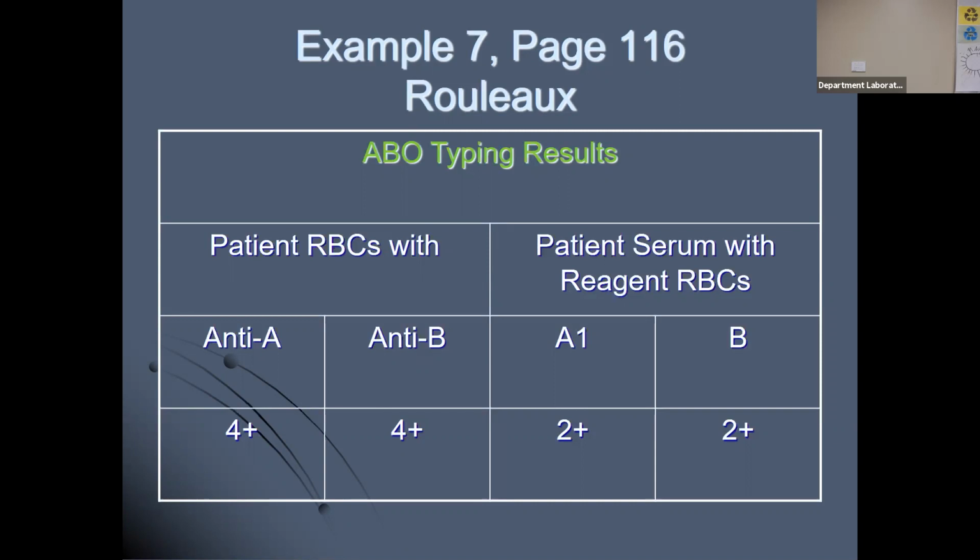And remember a couple lectures ago, I told you to never look at your ABO interpretations under the microscope. In typical situations, you wouldn't. In this case, if you were to look at these 2 tubes under the microscope, what would you see? You would see the stack of coins. You would see Rouleau. That's another way you could say this is not true agglutination, that is Rouleau. And then you could do the saline replacement. It would disperse these results and give you your negatives, so then your front and back match.